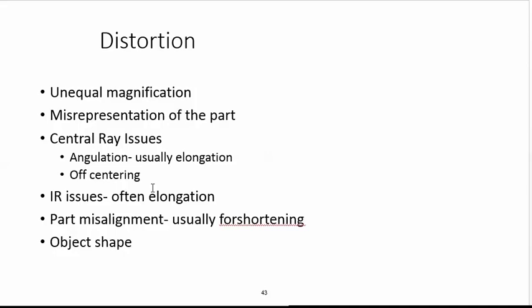You can see this if you took one of those small jugs of barium that's maybe the size of a, I don't know, traveling cup, a travel mug, and you place it right in the middle of the table, pull the fluoro tube across and lock it in, and then fluoro over the top of that jug of barium, you'll see the change in the appearance of the jug of barium in the periphery of the radiation field. What you've got going on there is what you call the parallax effect. The parallax effect is change in appearance because of position, basically.